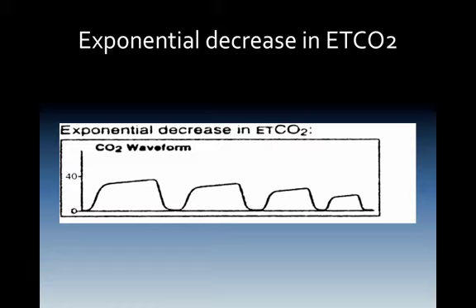They have dislodged and placed in their pulmonary trunk a pulmonary embolism. Sudden hypotension from massive blood loss, like say an AAA balloons out and ruptures. And if the patient has been placed on cardiopulmonary bypass, we would also see lower and lower amounts of end-tidal CO2, because the machine is now functioning as a heart-lung machine, so to speak.